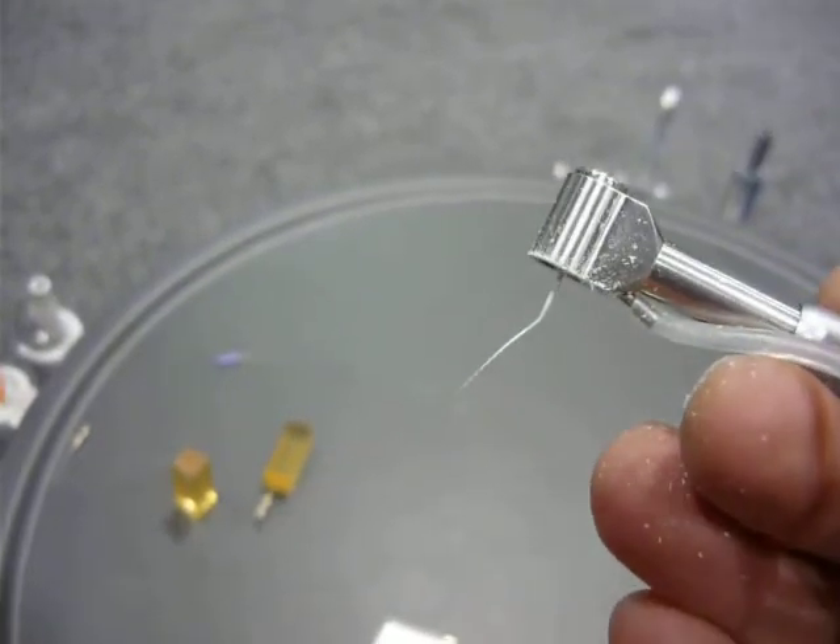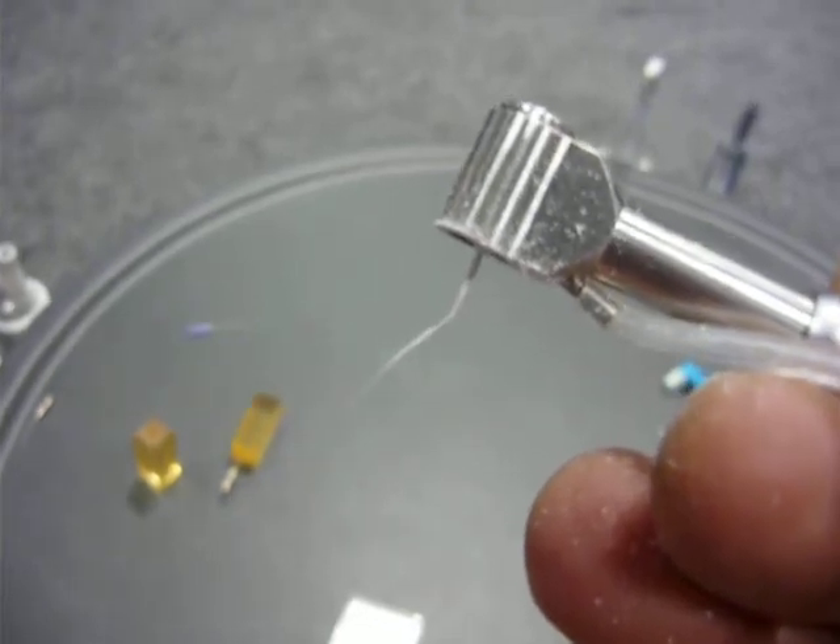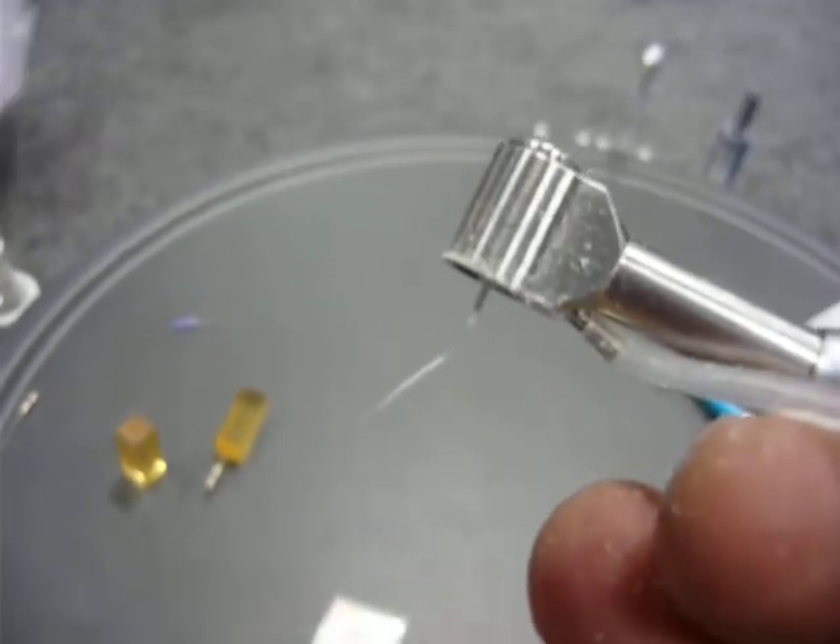Notice the file has not broken. Vertical reciprocation prevents the instrumentation from fracturing due to no torque stress on the file.